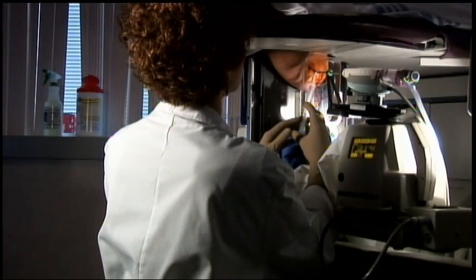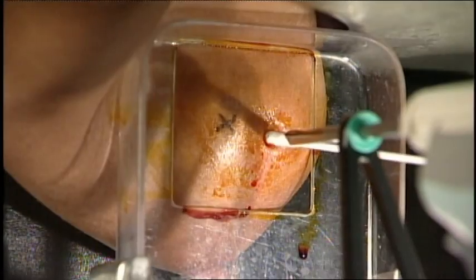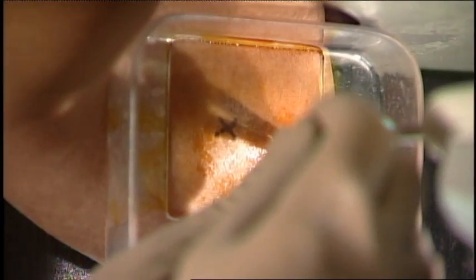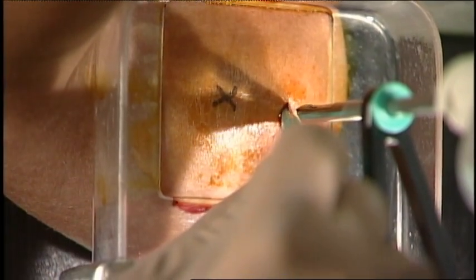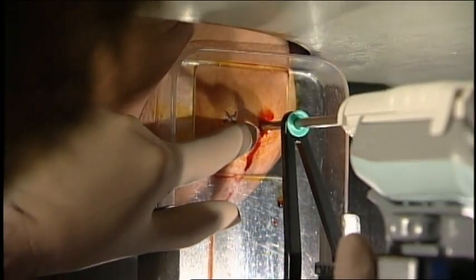We're going to go over and get her anesthetized. First thing we're going to do is numb the skin, and then I usually will numb to the level of the Z-depth of the calcifications and also one centimeter deep to the calcifications, in case I need to push the probe in a little bit deeper.